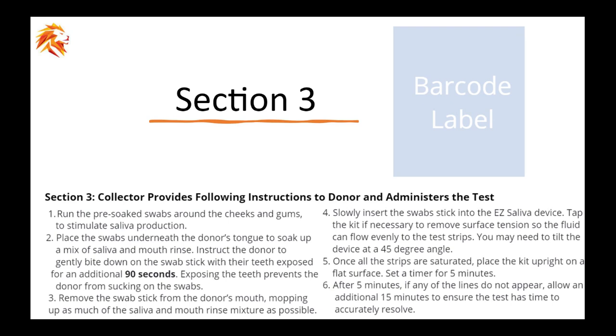Once the strips are saturated, place the kit upright on a flat surface and set a timer for 5 minutes. After 5 minutes, if any of the lines do not appear, allow an additional 15 minutes to ensure the test has time to accurately resolve.